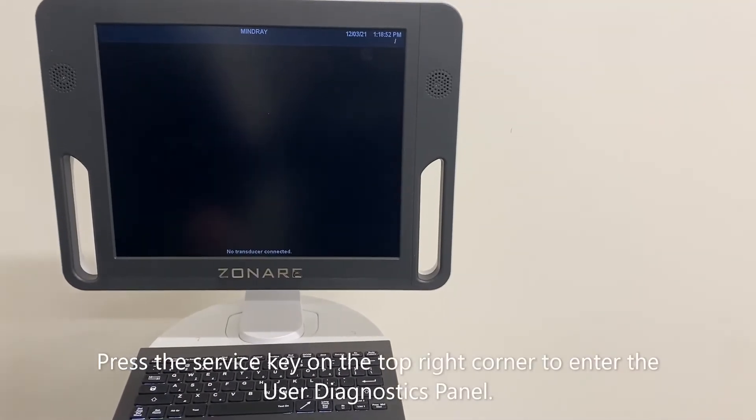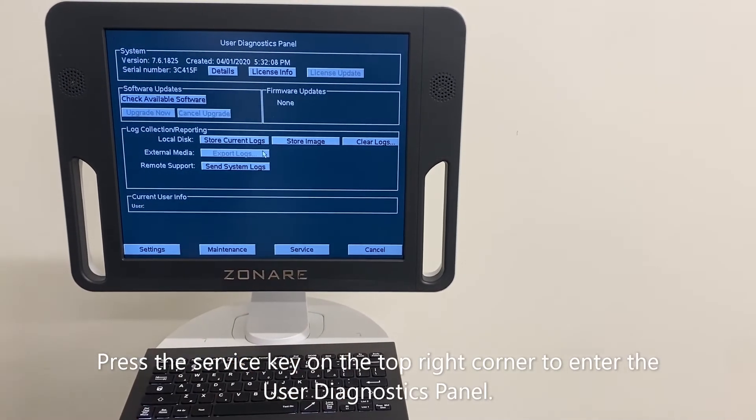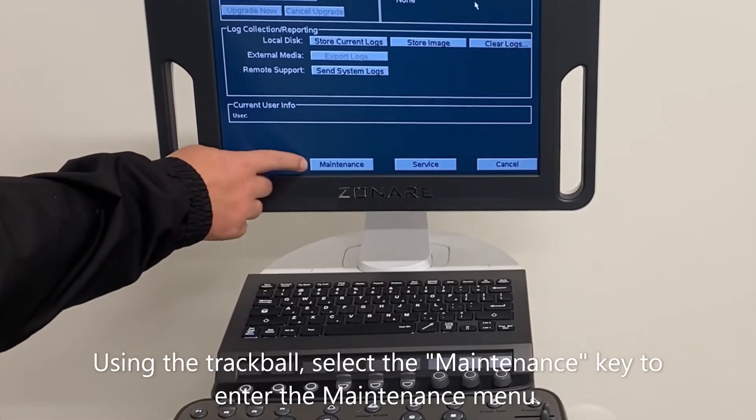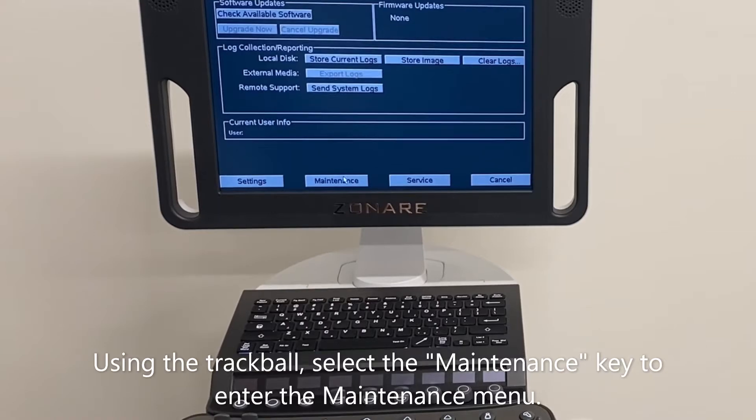Press the service key on the top right corner to enter the user diagnostic panel. Using the trackball, select the maintenance key to enter the maintenance menu.